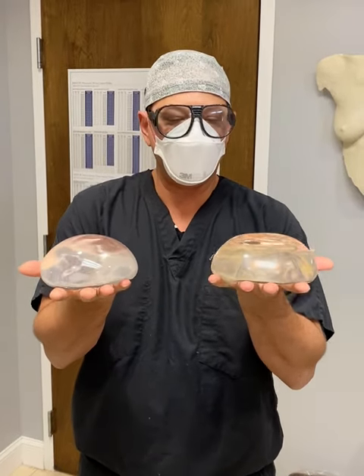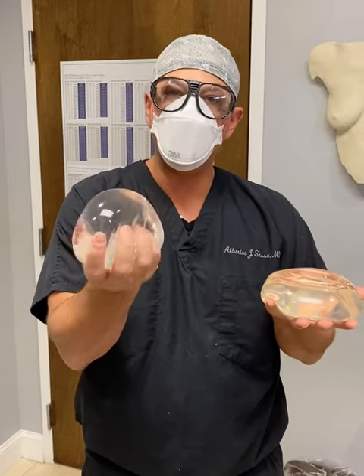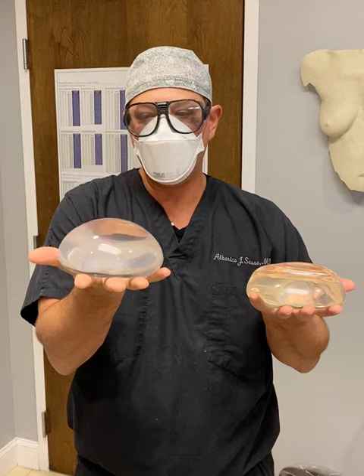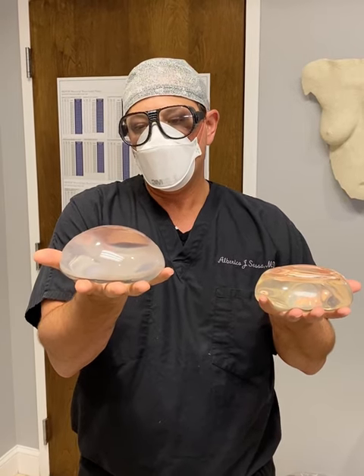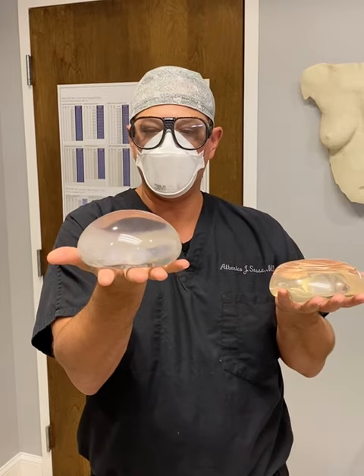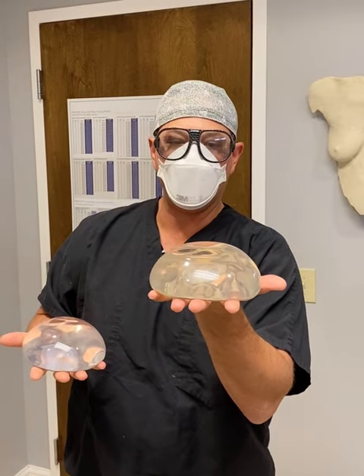Today I wanted to talk about two different types of implants that we use here. This is the Gummy Bear implant — a silicone gel implant. It's smooth, round, and high extra, so it's very close to what you would call an ultra high profile implant versus a high profile implant.